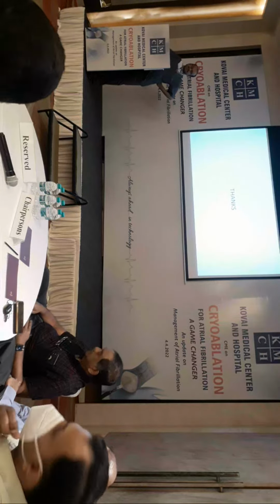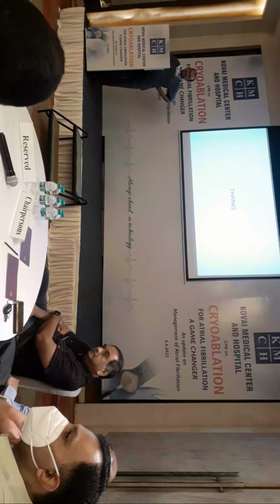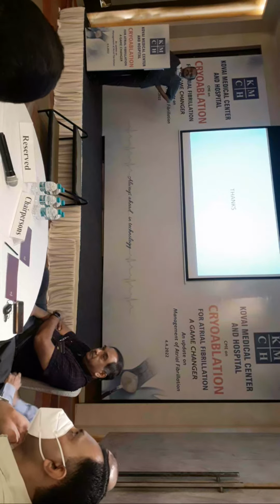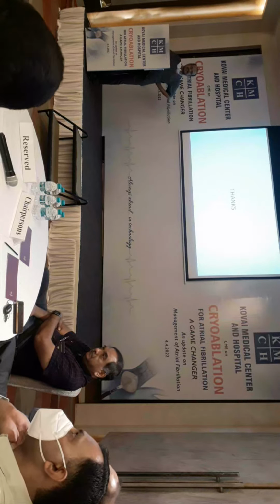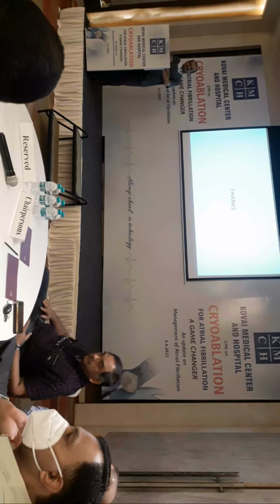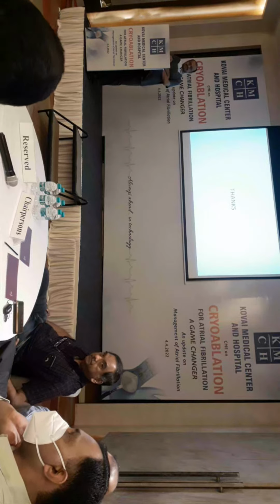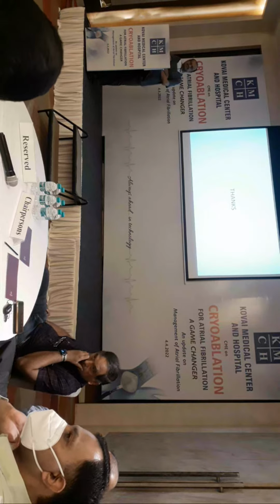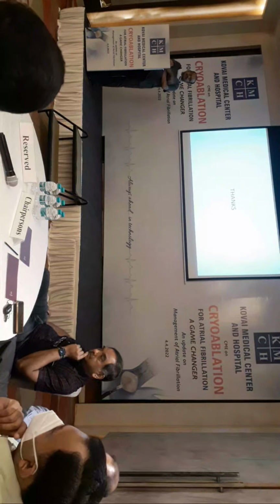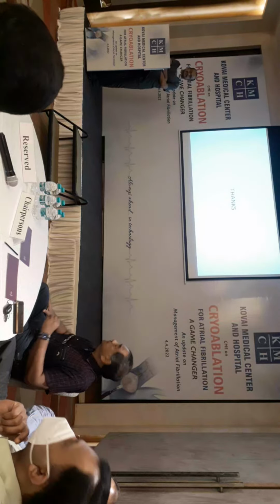There was an article recently in JAMA you might have come across. For drug-naive patients, the immediate treatment goes in for cryoablation. Yeah, that was the recommendation. That's what I was telling, that's where we are heading now. They have done a study with 300 odd patients and found it was very useful when the patient's initial treatment is a cryoablation. Cryo being a primary strategy, even in drug-naive patients. Thank you.